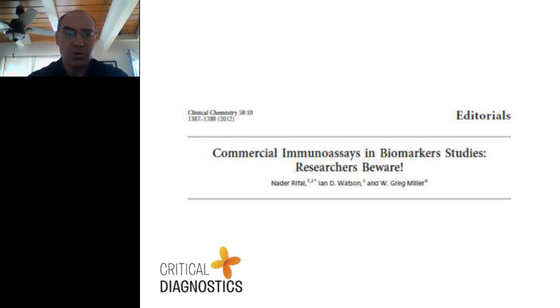They may work well, but those manufacturers usually only go through very modest validation and standardization protocols, and consequently, you may not understand or recognize that those tests could be affected by inhibitors that naturally occur in your biological specimens. They may not be as specific to the analyte that you're interested in. They may be compromised by sensitivity.